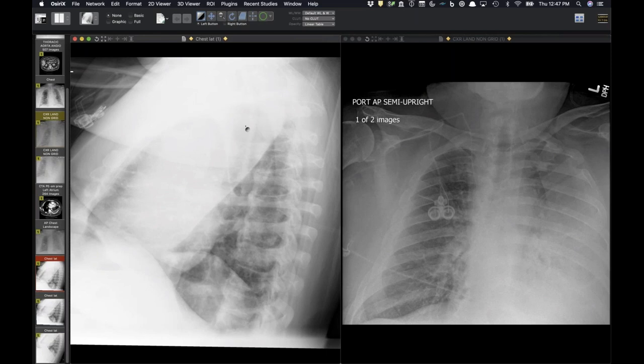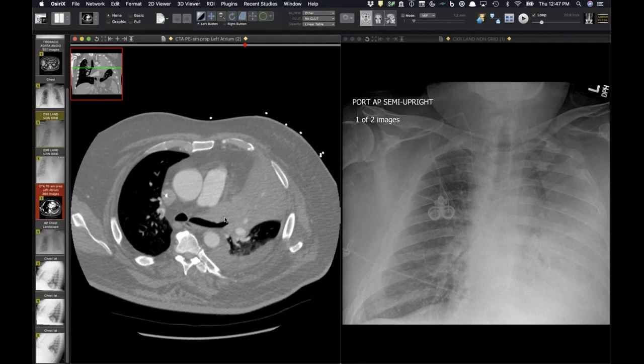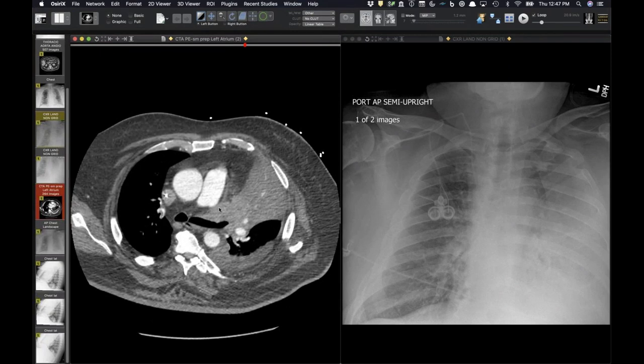Clearly his arms are both up, and you don't see humerus right in here, but yeah, it's such a pronounced anterior opacity from the left upper lobe collapsed anteriorly. So this is really a drowned upper lobe with little volume loss. So probably just all full of secretions and stuff. Yeah, because the mass is.